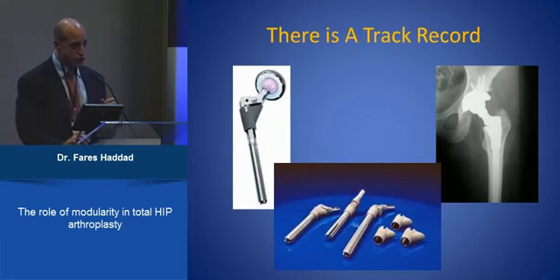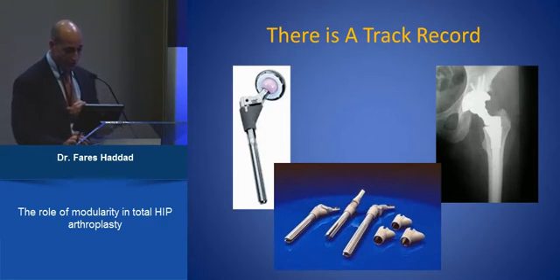Let's not get confused here, because I'm going to tell you some bad things about modularity. None of you would wish to discard the modularity that happens between the head and the neck. We're all too wedded to that. And there are some implants which have this kind of modularity that you see here that we're all very used to and that have an excellent track record.